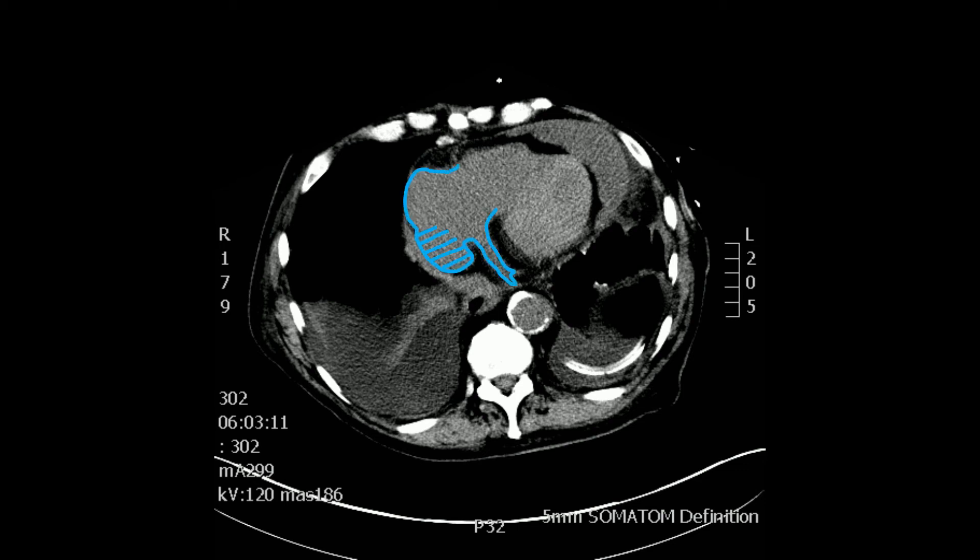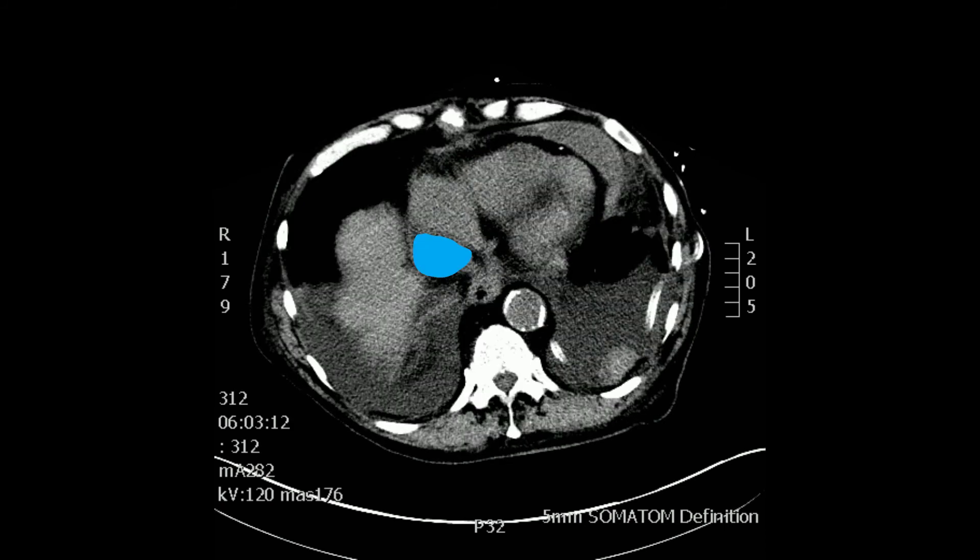You see now the right atrium and the area with the inferior vena cava–right atrial junction. And the coronary sinus, as well as a heavily calcified descending thoracic aorta.